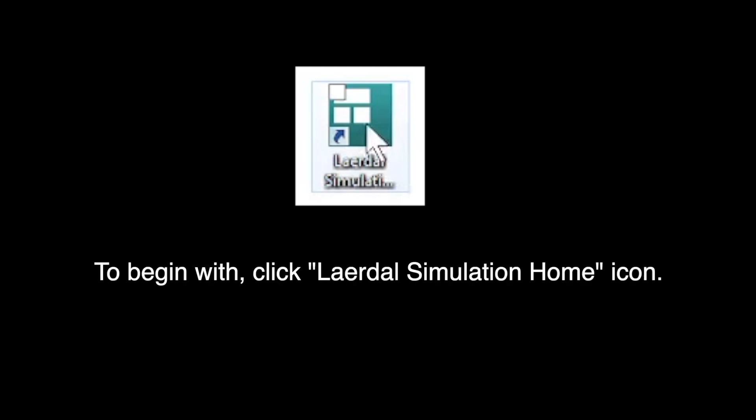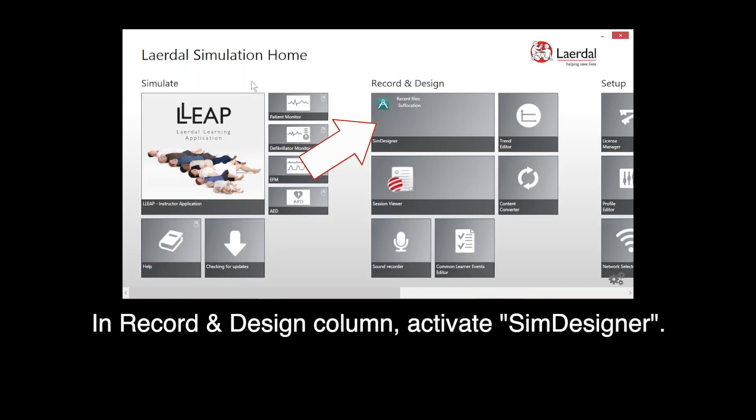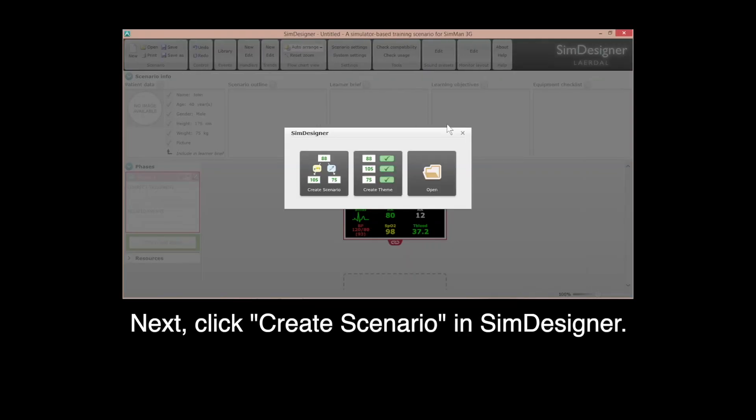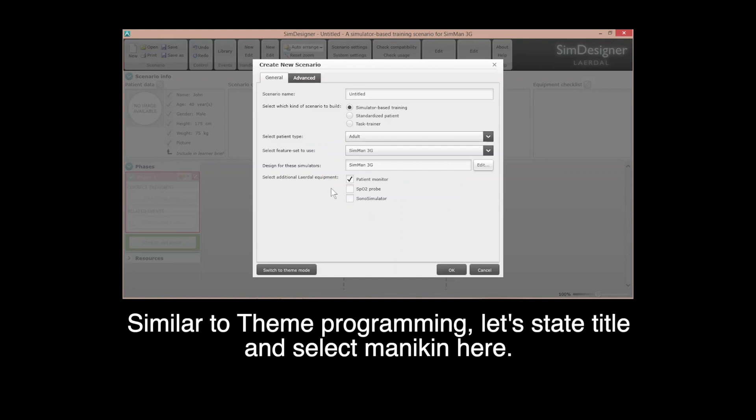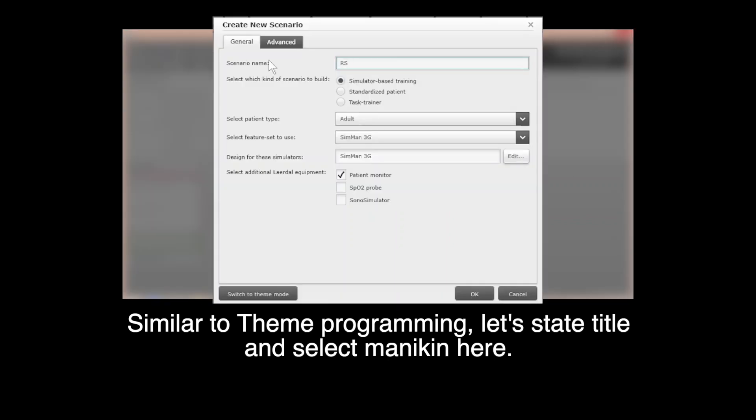To begin with, click the Laerdal Simulation Home icon. In Record and Design column, activate Sim Designer. Next, click Create Scenario in Sim Designer. Similar to Theme programming, let's state title and select MANIKIN here.